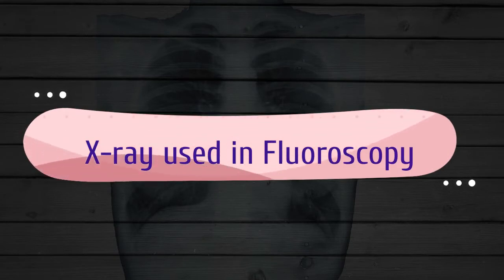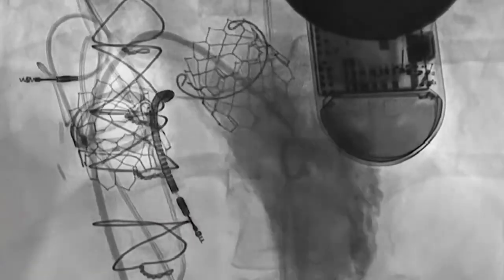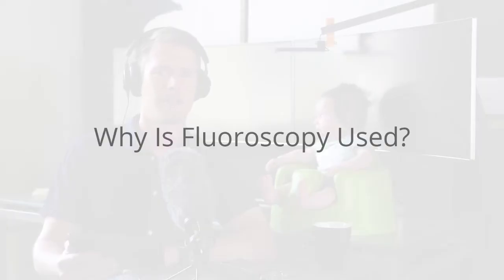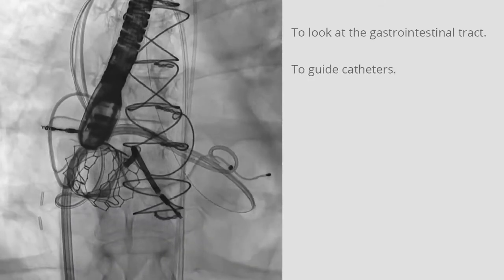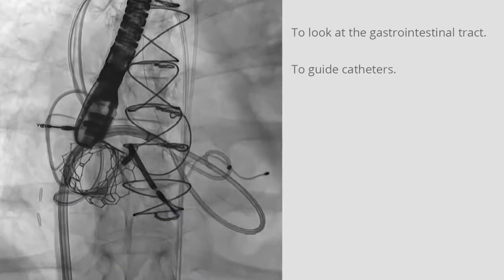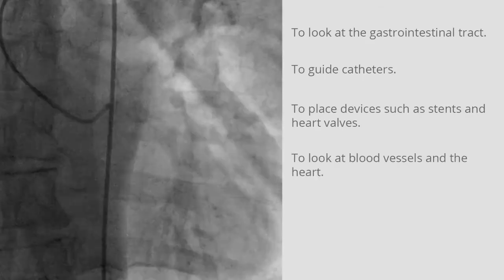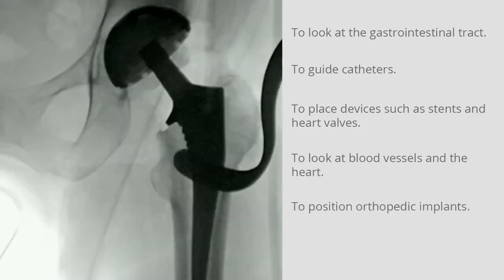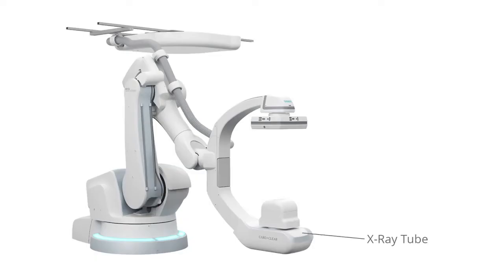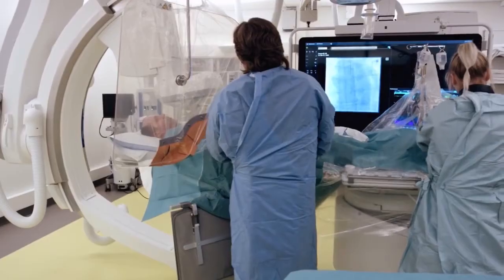Fluoroscopy. Fluoroscopy produces real-time images of continuous movement within the body shown on a fluorescent screen and recorded for analysis at a later time. It shows a live image of the patient's internal structures and can follow the path of an injected contrast substance. A fluoroscopy test depicts real-time images of a beating heart or the blood flow to the muscles of the heart. It is also used to position a pacemaker or catheter, orthopedic implants during a surgical procedure, or to view contrast agents. This is also the same technology used during a barium enema to view movement through the gastrointestinal tract.